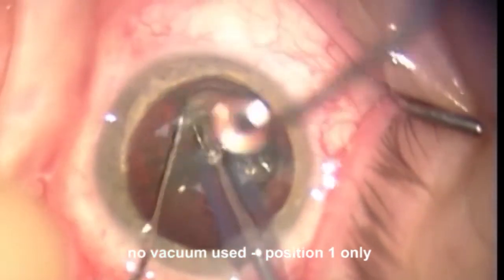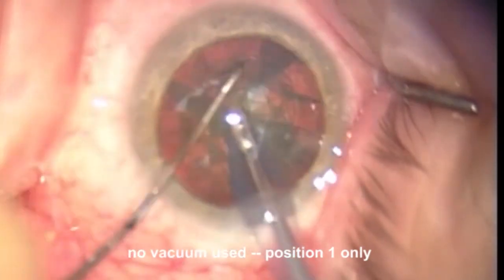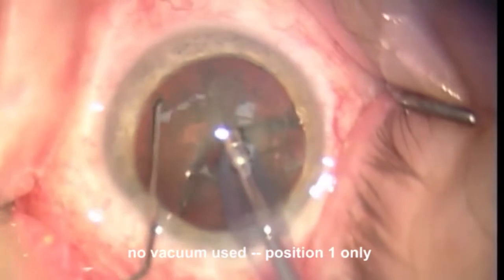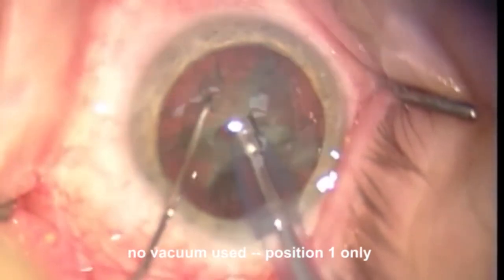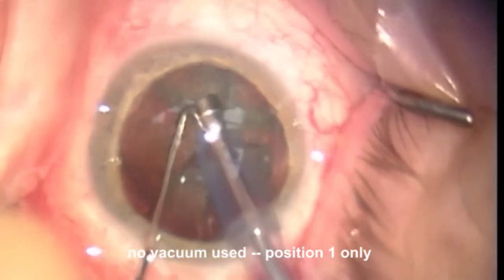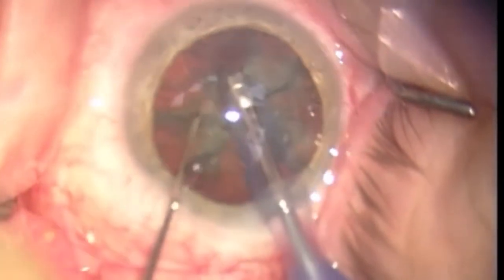This technique is very useful because if you use a fair amount of vacuum with a soft lens, sometimes you'll bore through the soft nuclear material and hit the posterior capsule. In a similar fashion, making a groove with divide and conquer can be dangerous because you can make the groove in the most periphery and have it go all the way out and hit the posterior capsule.